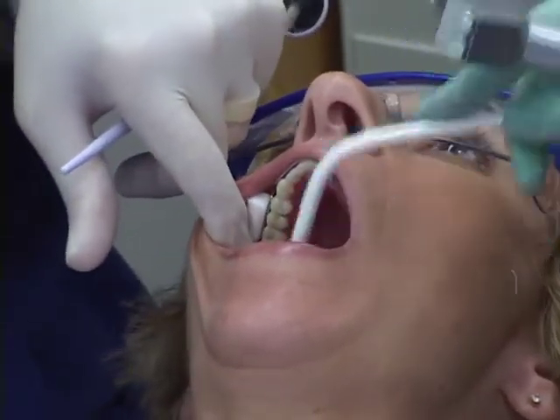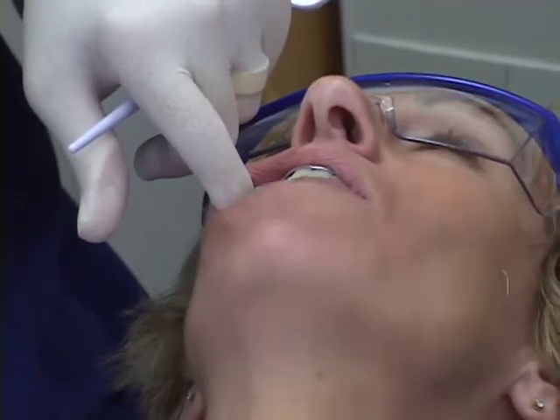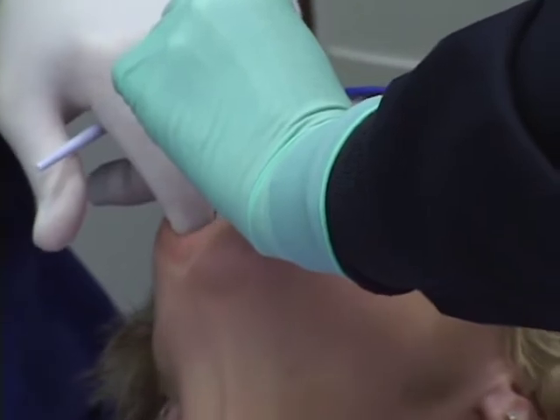Debbie, go ahead on your own now. Tap, tap, tap, tap. Do you feel anything on the left side touching it at all yet? No. Okay, open. Okay, let's keep going. Tap, tap, tap, tap. Open.